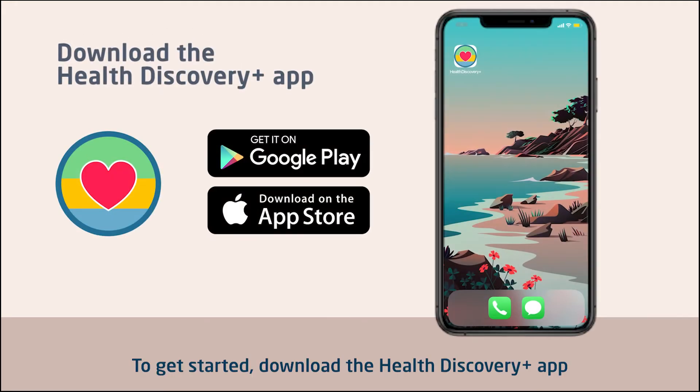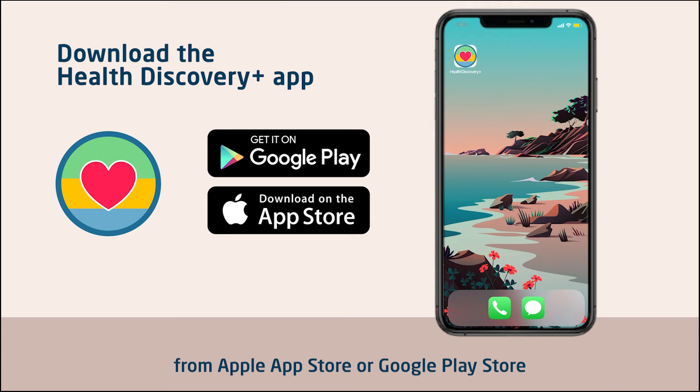To get started, download the Health Discovery Plus app from the Apple App Store or Google Play Store.